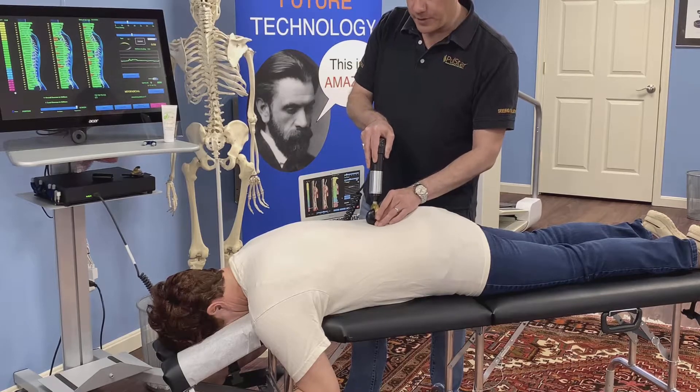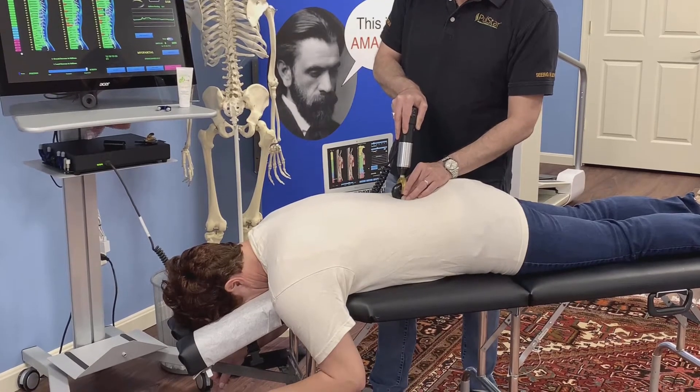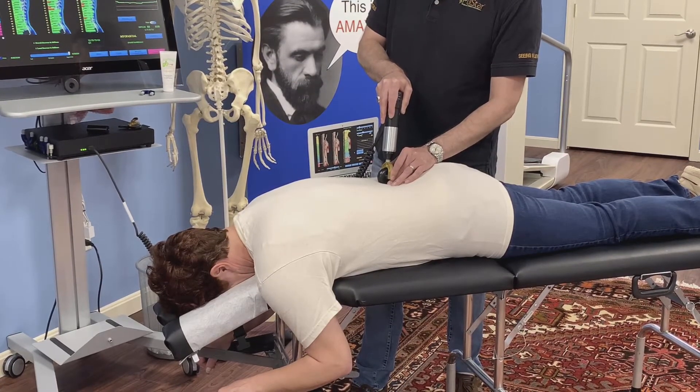In myofascial mode, it's a very high rate — about 30 to 50 impulses per second — and it depends on how hard I press as to how fast those impulses go. If I press slowly, I'll stay at 30 impulses per second; if I press harder, we'll go all the way up to 50.